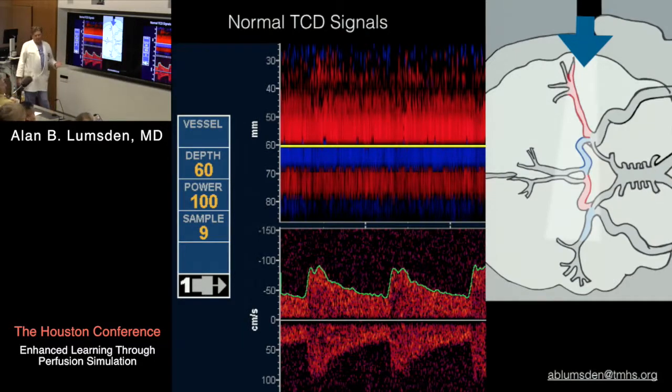But it was also kind of interesting because we now got the bypass in. This patient needed to be debranched. And we clamped the right carotid when we're inside the chest to see if we could bypass it. And he goes, perfect. Flow is going across here. Everything is red on this side. Everything's blue, actually. It's flowing away from the probe, but you're perfusing the brain. Flow velocity drops, comes back up to about 70-80% of baseline. Golden. Take the clamp off.